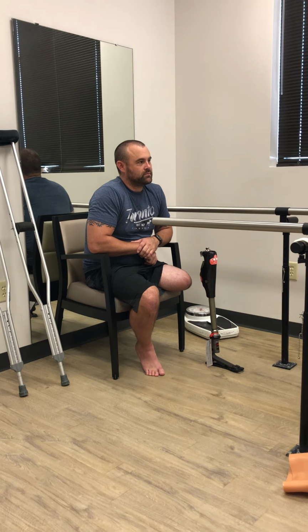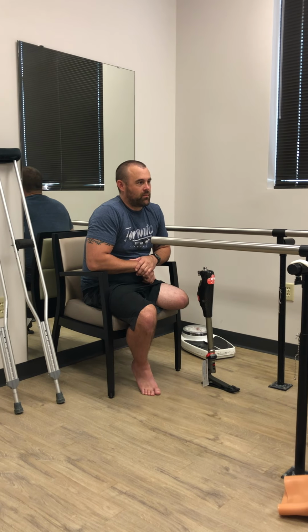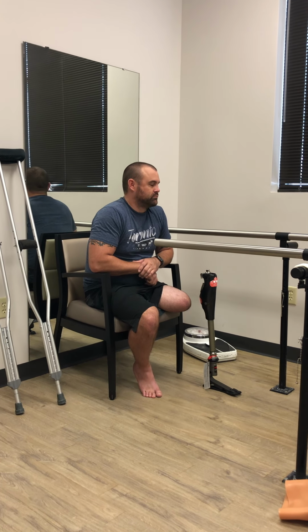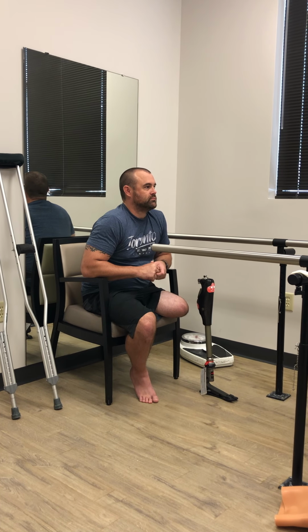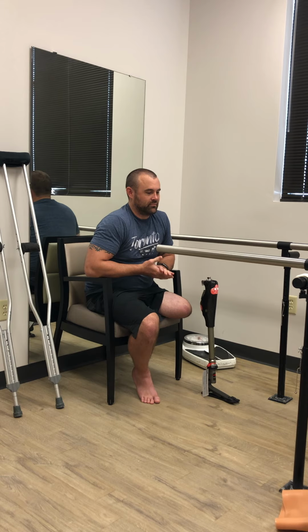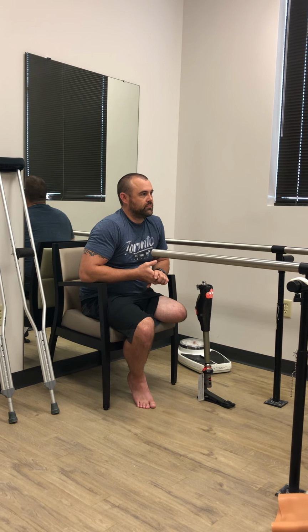If you're an inch out of the socket, then the leg's an inch longer, because you're adding that to a device that's already stabilized. So it just got taller. In fact, yes, the leg did get longer. Why? Because you're not down in the socket appropriately. So it kind of reverts back onto the patient.